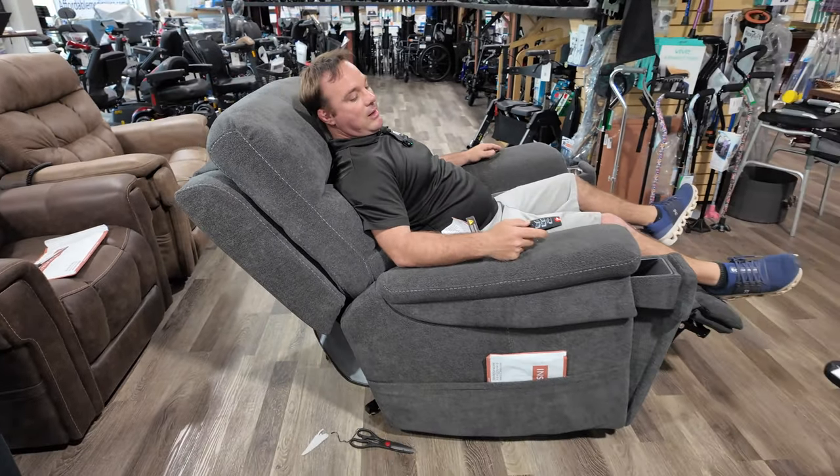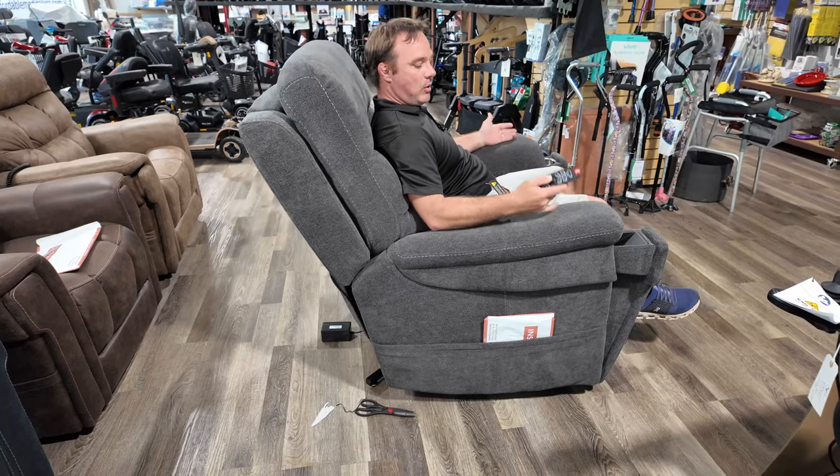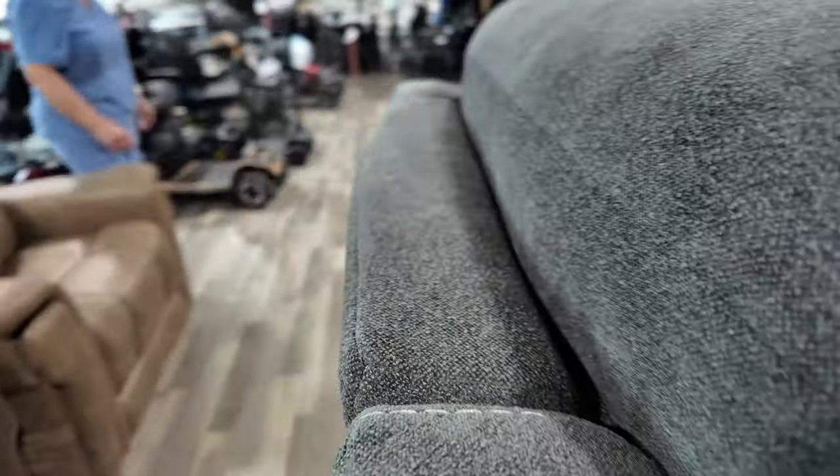It's a great chair. With the new fabrics — the old fabrics are okay, but now they give you more options. People want cloth, and this is it. It looks very durable, and obviously it's going to raise you up.